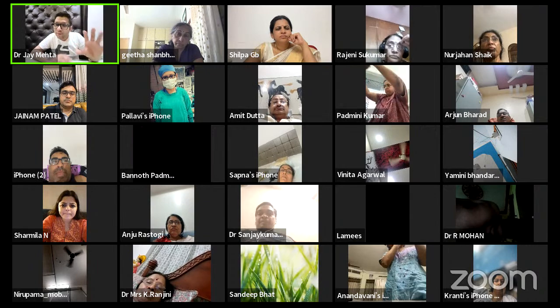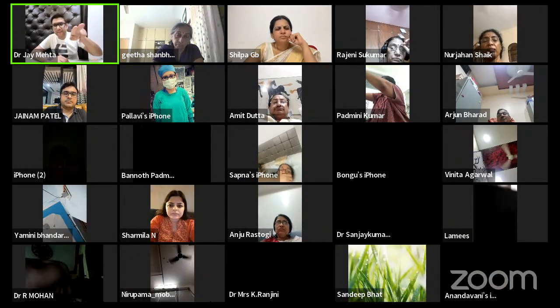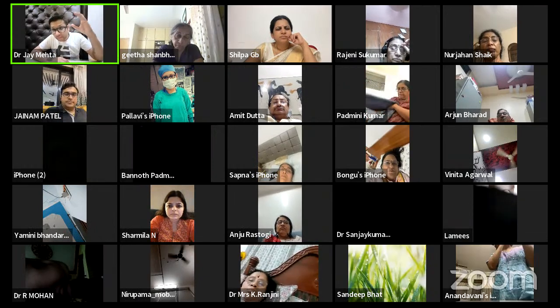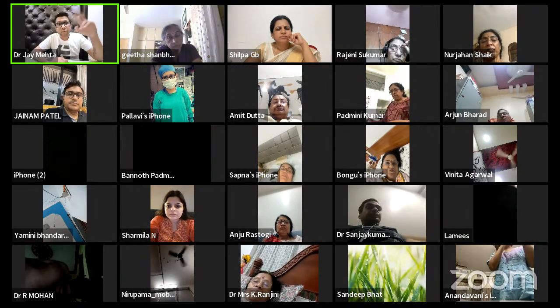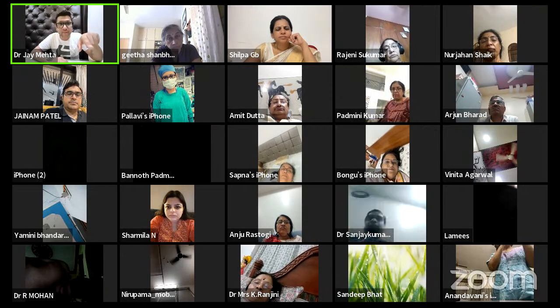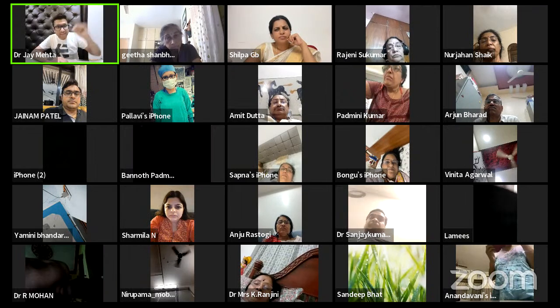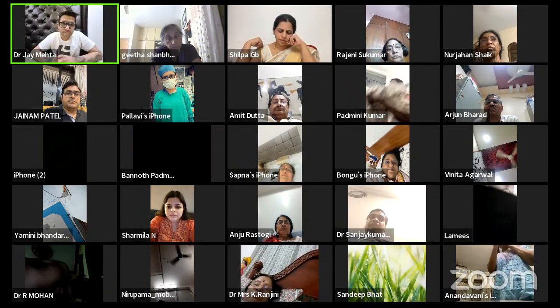But that is not true for hysteroscopic adhesions. In adhesion, what people normally do is a cut in the center. No, it's an adhesion because there is some fibrosis on the anterior wall and posterior wall. So you must actually do excision, like how we did it in Bangalore. Remember that girl who started getting menses? We excised that entire adhesion. So when you excise that adhesion, the patient usually responds well.